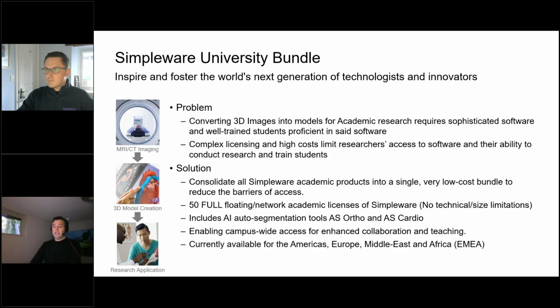So the problem is converting 3D images into models for academic research requires sophisticated software and well-trained students proficient in said software. So, you know, I was a grad student. We had a license of Simpleware, and we played musical chairs on the one computer where we could afford a license. So I'm sure plenty of people have dealt with that. Because there's complex licensing and high cost, it limits researchers' access to software and their ability to conduct research and train students. So it's a real limitation.